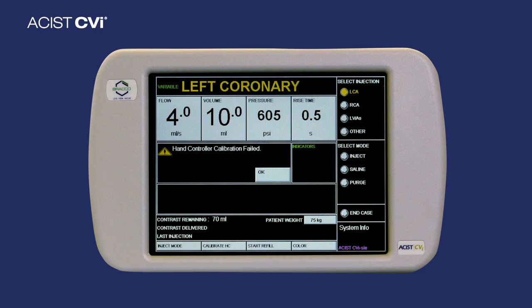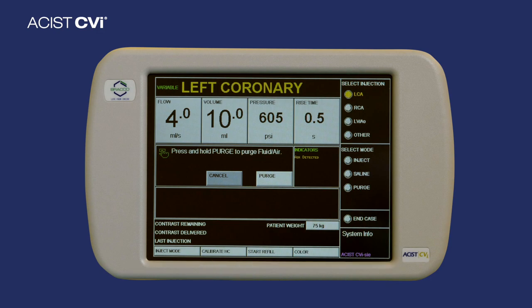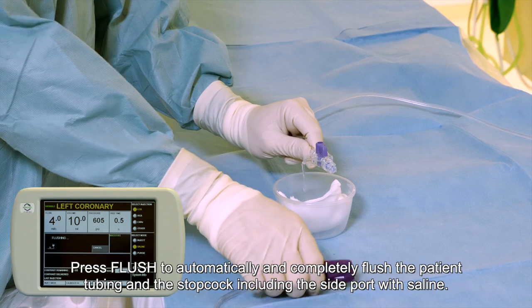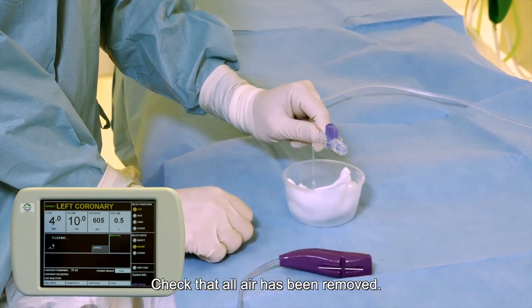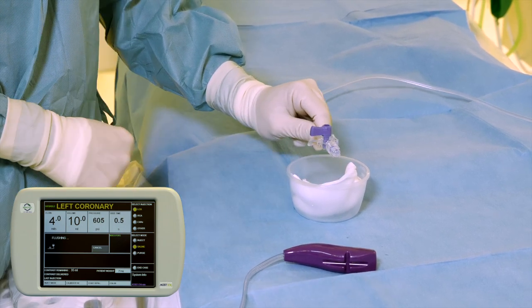OK on the screen. Press the purge button for 1 to 2 seconds to remove air through the air column detect sensor. Press Flush to automatically and completely flush the patient tubing and the stopcock, including the side ports, with saline. Check that all air has been removed. Repeat if necessary until all air is removed.